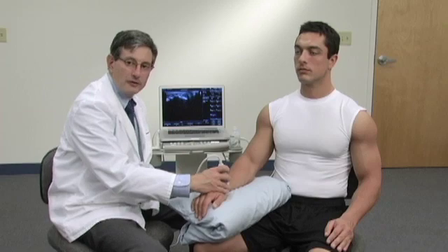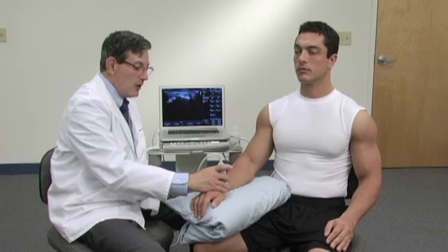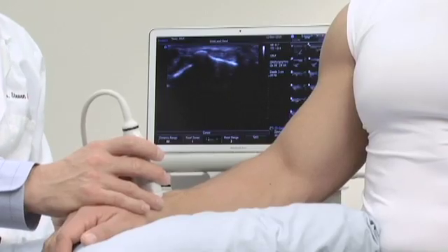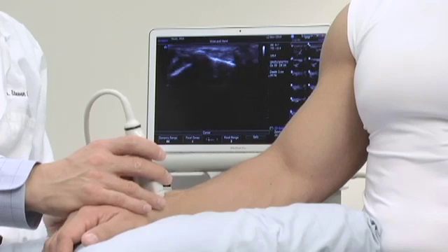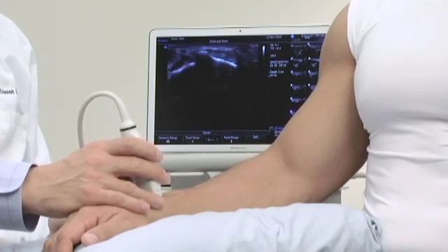Briefly, we will review the other tunnels of the wrist. These tendons can be followed all the way from their musculotendinous junctions and should be followed from their musculotendinous junctions to their insertions to fully evaluate them. We'll move from the radial side to the ulnar side of the wrist and look at the rest of the tunnels briefly.